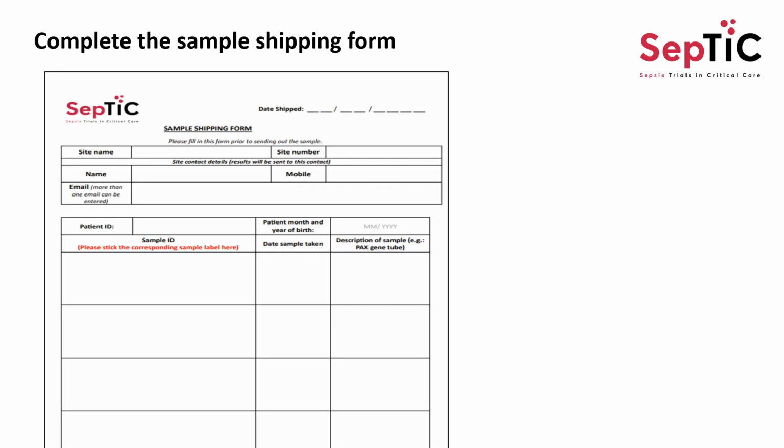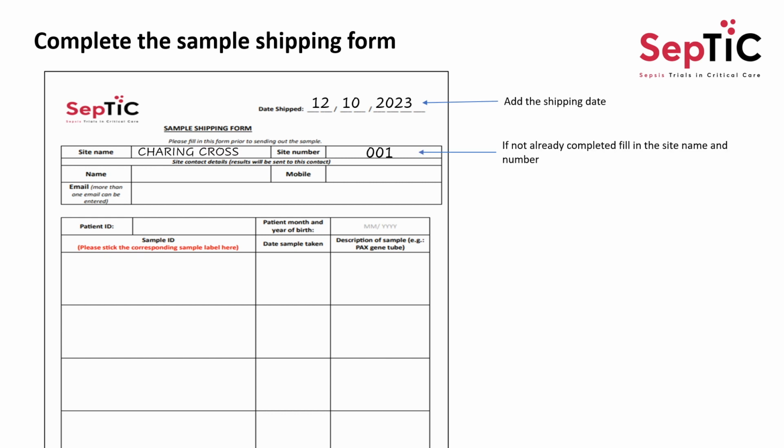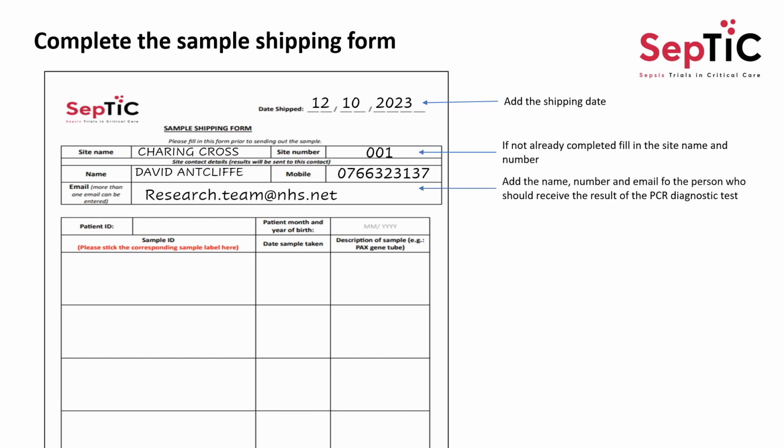The first thing that needs to be done prior to posting is to complete the sample shipment form. This needs to be completed with the date the samples were taken and shipped. If not already pre-filled, the site name and site number. The details of the person at your site who is to receive the result of the PCR test, including their name, telephone number and email address. And then the study identification number for the participant, as well as their month and year of birth.